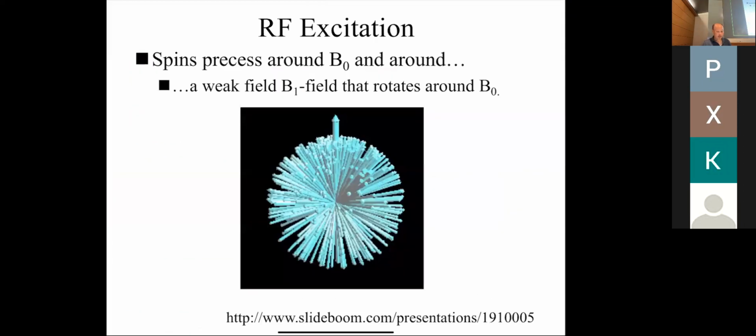Okay. So that's just a review of the B0 field, and that's pretty much all we're going to talk about the B0 field. We assume that we've got a magnet that creates a polarization. That's the signal we deal with. So we're going to spend most of the course talking about the RF field and the gradient field, because those are what allow us to take the image, and that's where all the action occurs. Typically when you buy an MRI system, you don't mess with the B0 field. You just buy that. What you're allowed to do through the software is, we have our grad students and staff scientists write programs, and we control the RF field and the gradient fields. That's what we get to control.